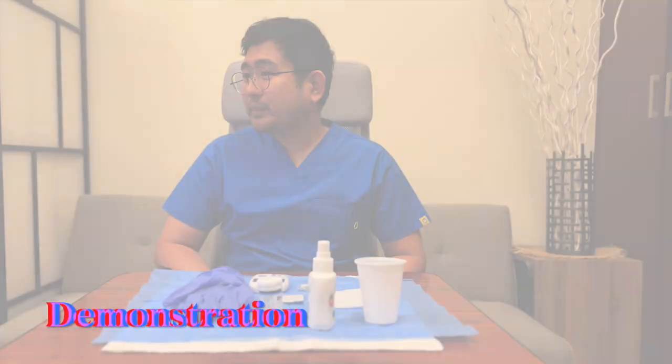So after the testing, documentation is your next priority. You have to record the time, value, and any intervention. If the results are abnormal, you have to notify the appropriate clinician immediately and always chart the patient's response and actions taken.